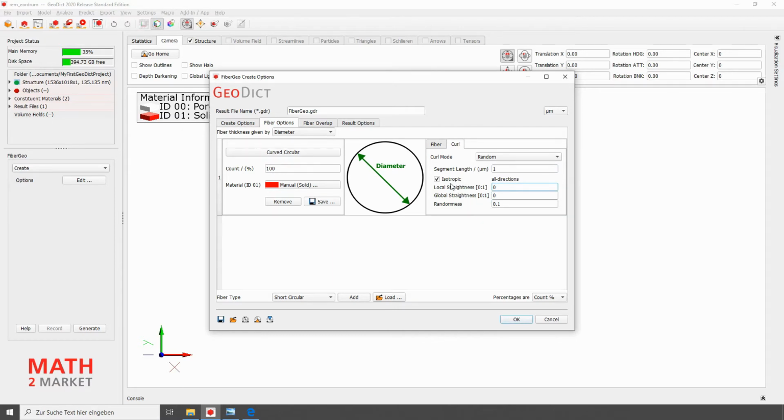The other parameters we need to enter are whether we want to use isotropic or anisotropic curvature parameters. If we use anisotropic parameters, we can enter the curvature parameters for each direction independently. Or if you choose isotropic curvature parameters, then the parameters are the same for each direction.